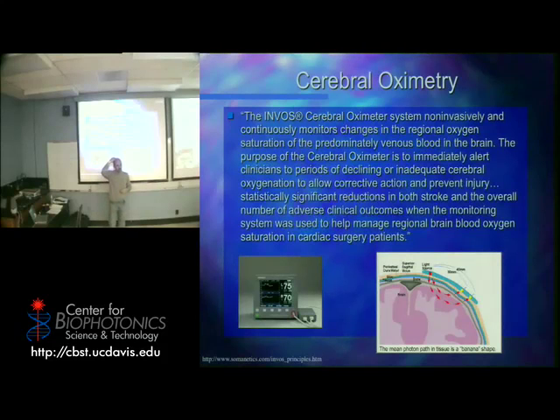The way light travels in your brain is in the shape of a banana. If I make a really bright light source here, they have determined that the majority of light, as it scatters and interacts with the bones, tissue and brain, comes back from the surface about 3 centimeters away, and from deeper parts of your brain about 4 centimeters away. So they know roughly where the majority of light comes through.